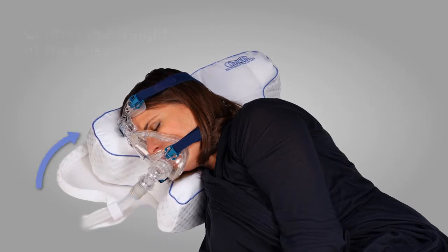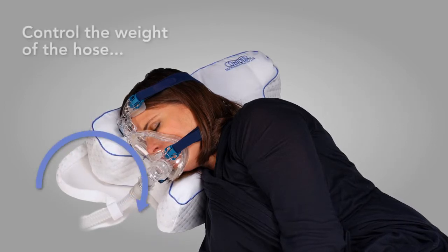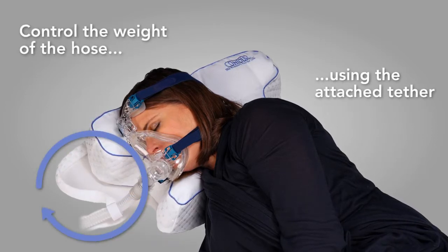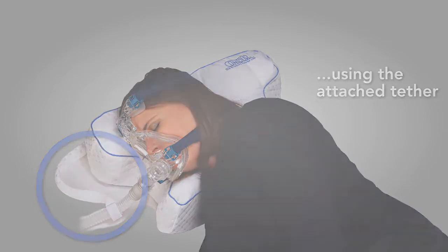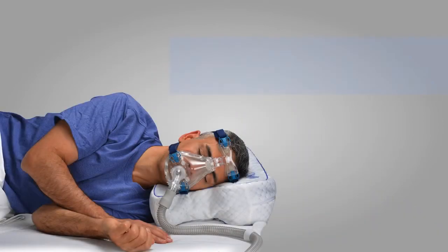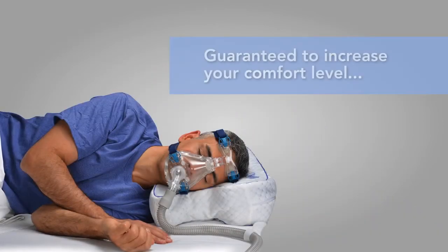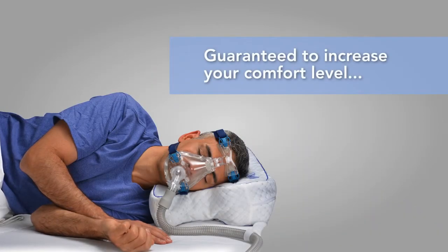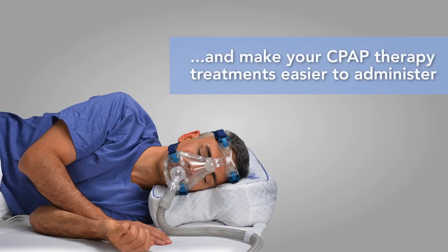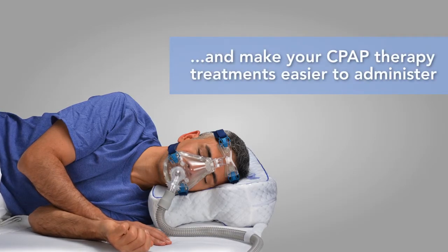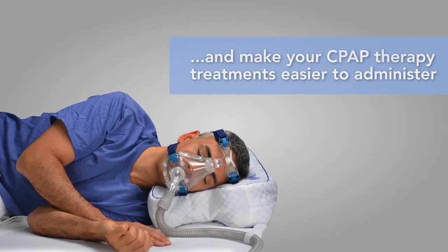Control the weight of the hose by using the attached tether. The CPAP Max Pillow 2.0 is guaranteed to increase your comfort level and make it easier for you to administer your CPAP therapy treatments.